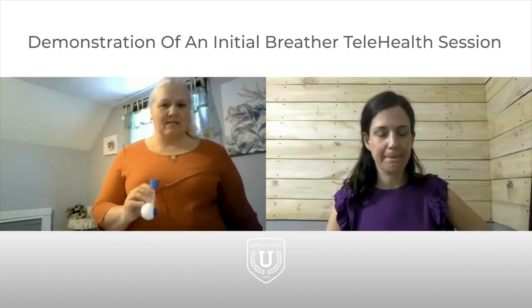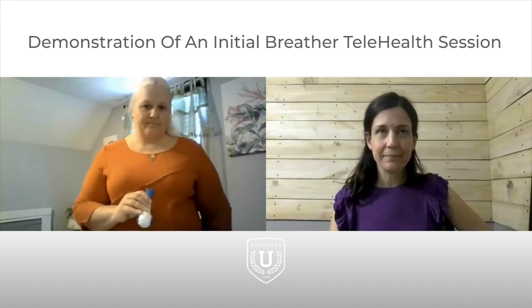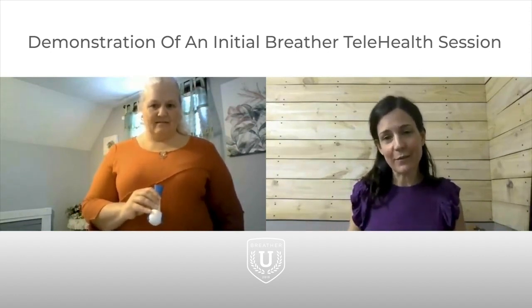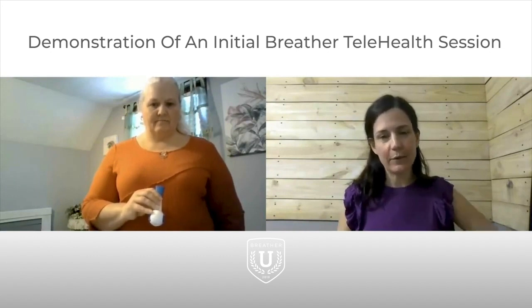Now, sometimes with my COPD, I'll cough if I'm talking a long time. What do I do if I cough while I'm doing the breather? Just take the breather out of your mouth, let yourself cough, and if you need to take a break, that's fine. There's no penalty if you did 7 and you stopped and coughed. That would be an okay set, or if you wanted to give yourself until the next commercials and then do another bonus set, that would be fine. Okay. I feel okay so far, but just in case. All right.